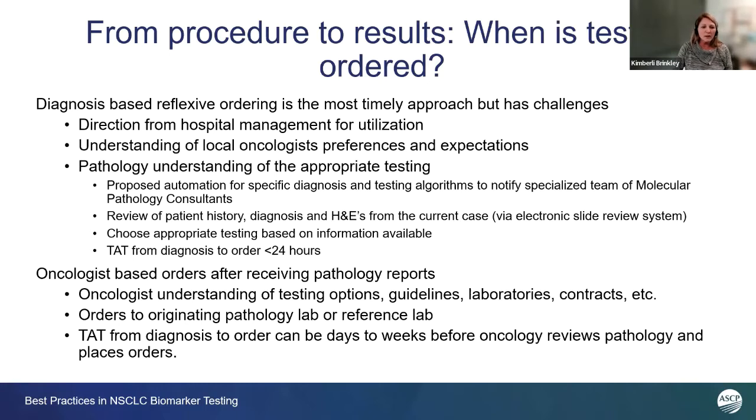So the role that I have here in the laboratory is taking those orders for the particular testing, and then how we manage moving the specimens through that process into the testing laboratory, and then finally presenting results to those oncologists.